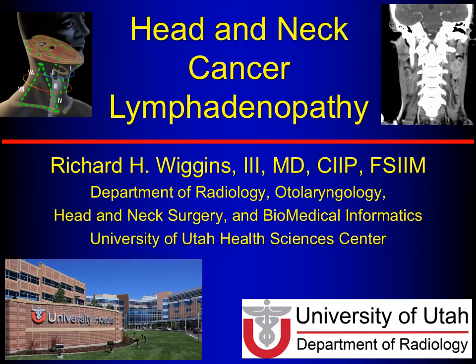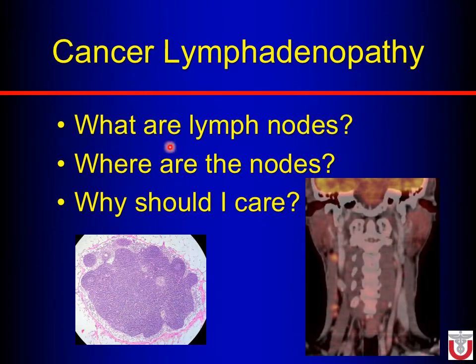Hi, this is Rick Wiggins from the University of Utah, and today we're looking at head and neck cancer lymphadenopathy. So we're going to talk about what are cancer nodes, and where are the nodes, and why you should care.